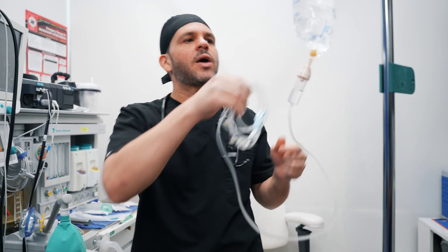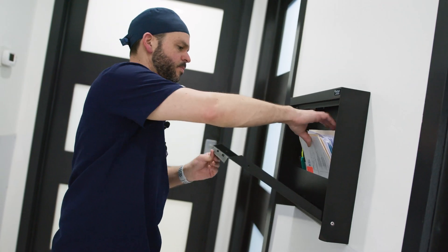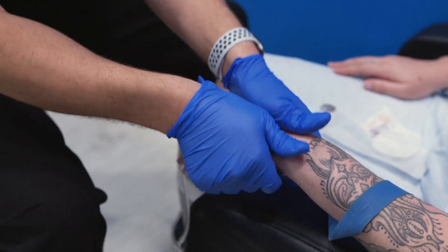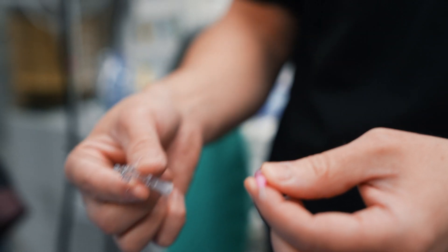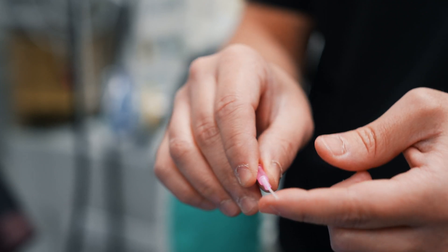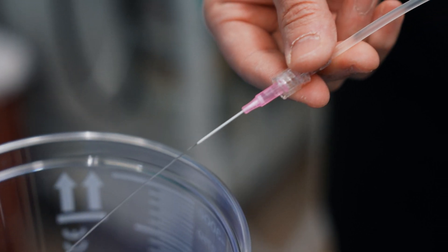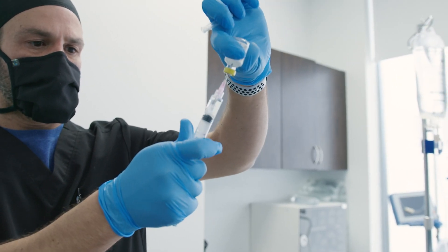Once that's set up, my IV line is ready and I have all my medications ready and all my airway equipment checked and set up. At this point I'm going to see the patient and start the IV. I usually use a Tegaderm — a small transparent sticker — to secure the IV and prevent anything from getting access to that puncture point. After I insert the IV, the needle does not stay in the patient; the only thing that stays is a little plastic nylon catheter, so it's safe to bend or move your arm. Once I connect my IV line, I'm able to deliver fluids continuously and also medications — this is how I inject medications at the beginning, during, and sometimes even at the end of the case.